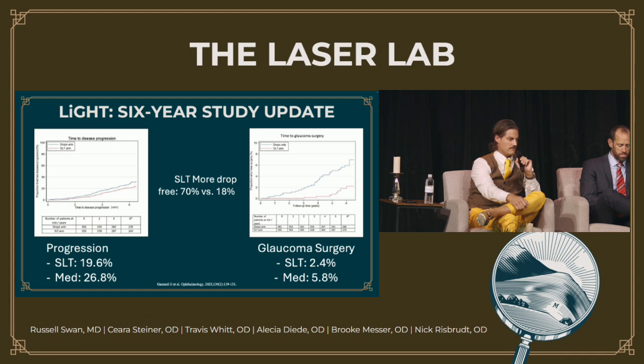And I hope there to be a shift. Instead of when you first diagnose a patient with glaucoma, it's a reflexive thought to prescribe a drop, and we've been doing that for years, now I hope there's a reflex to send for SLT because the data's too good. Yeah, I think that's super well said.